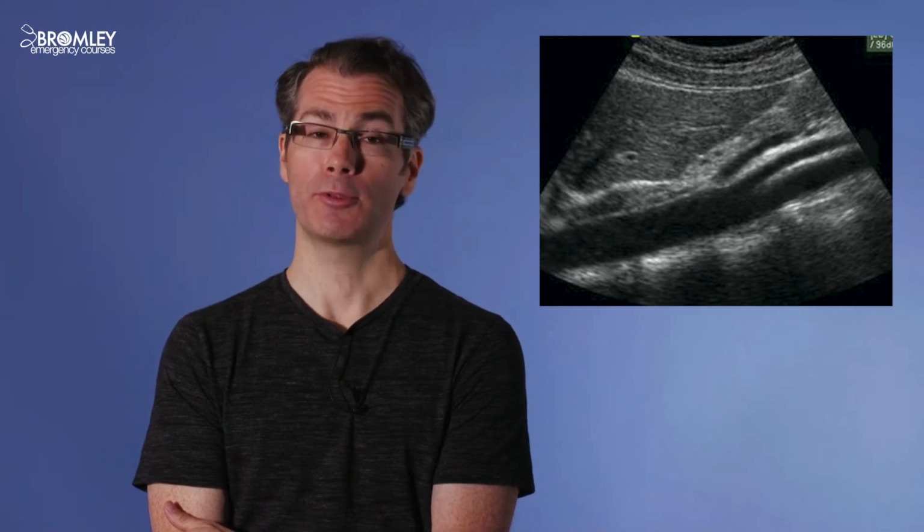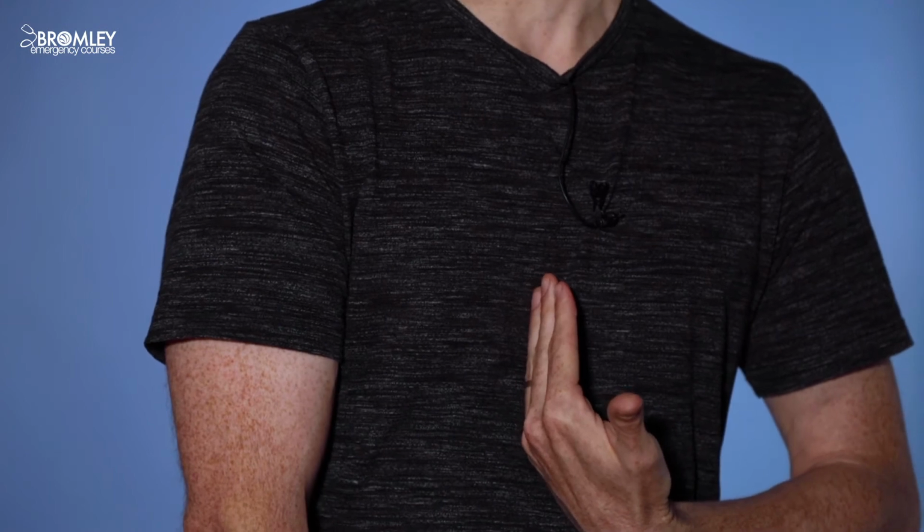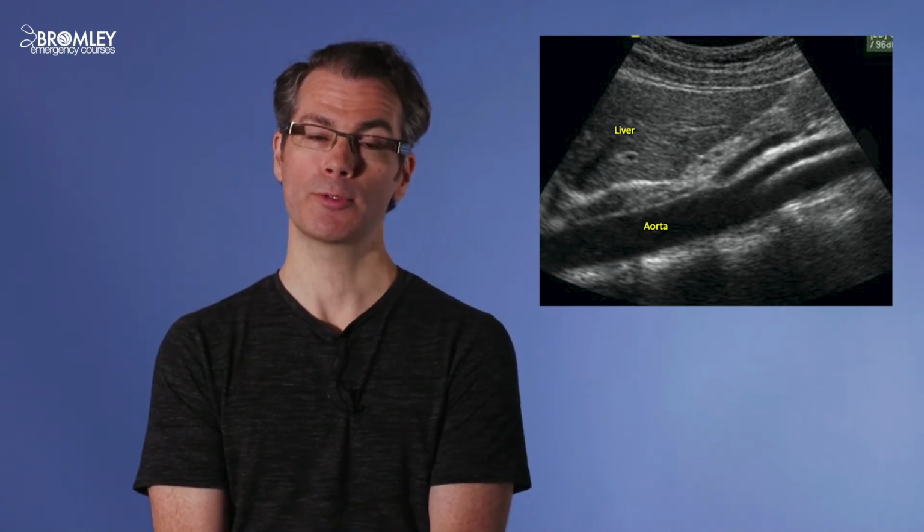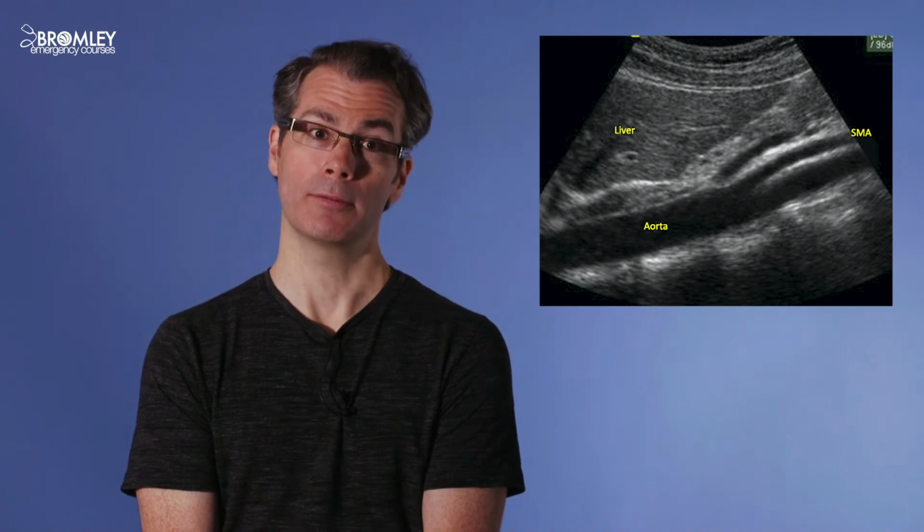So here we've rotated the probe through 90 degrees, so we're in the long axis, with the probe marker to the patient's head. So at the top of the image, we have the liver. Deep to this is the aorta, and you can also see the SMA, which branches off the aorta and runs along parallel to the aorta and just anterior to it.